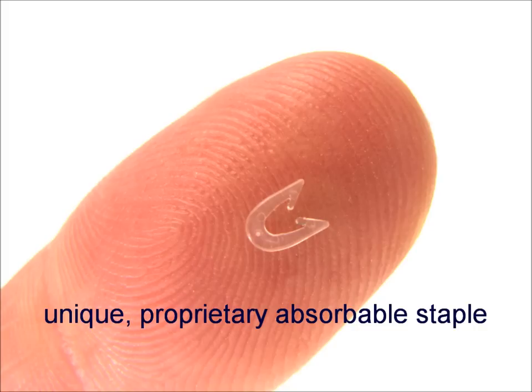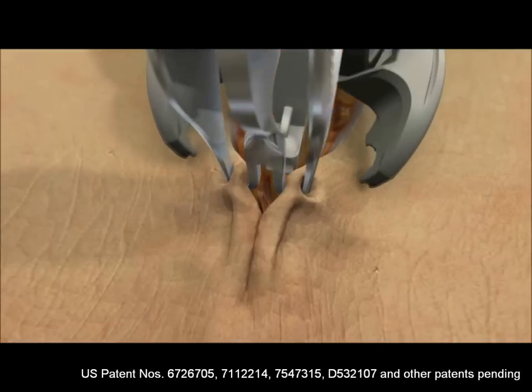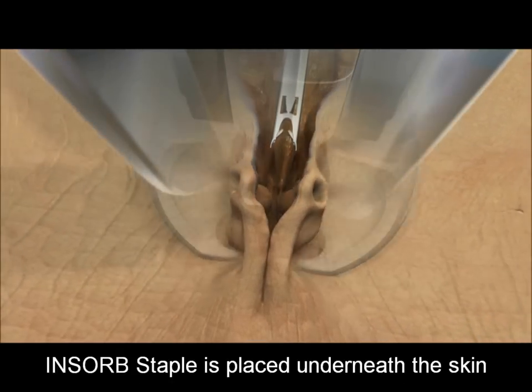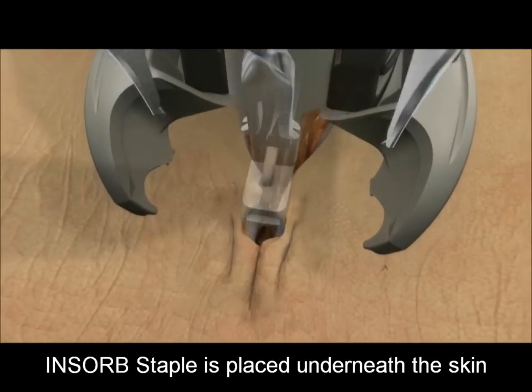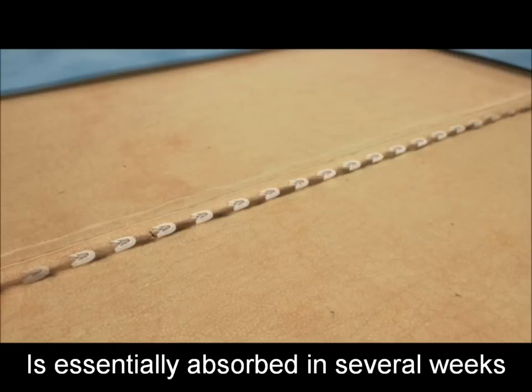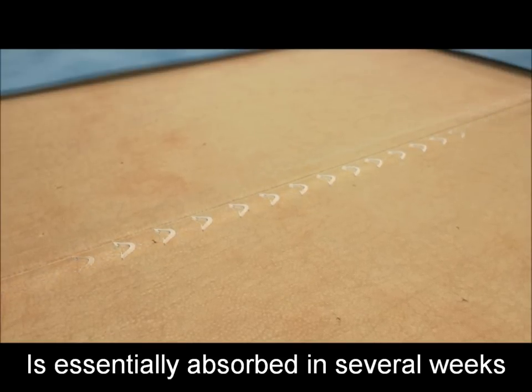The InSorb stapler utilizes a proprietary absorbable staple to close a surgical incision. The InSorb absorbable staple is placed entirely underneath the skin. The InSorb staple breaks down and is essentially absorbed by the body, just like absorbable sutures, in a matter of weeks.